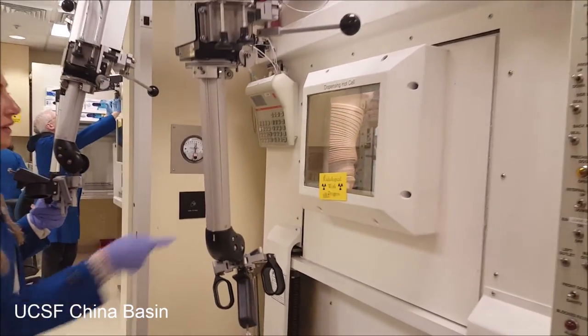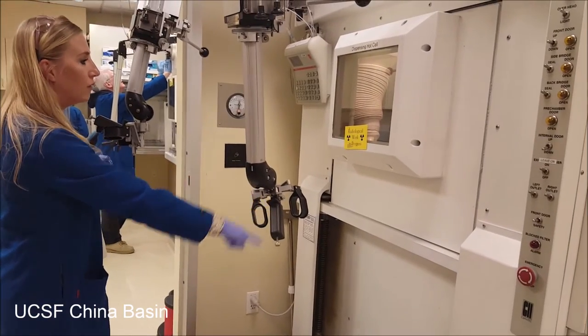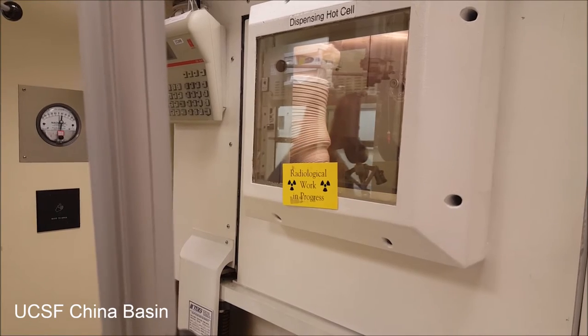So then we can drop the activity in the well counter — there's a dose calibrator that sits right in the front of this, you can see it if you pick your head in.